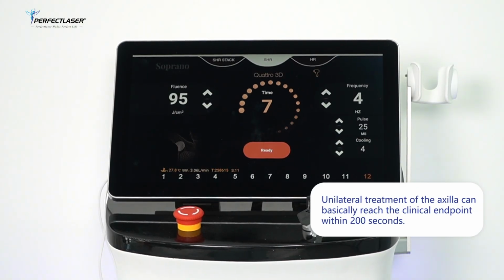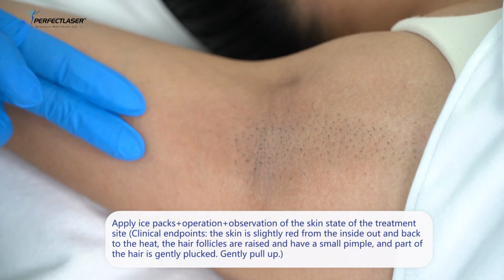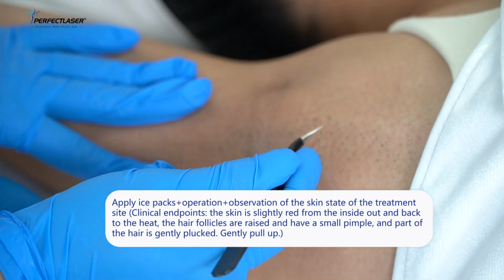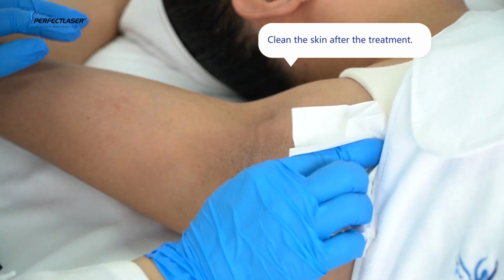Unilateral treatment of the axilla can basically reach the clinical endpoint within 200 seconds. Clinical endpoint judgment: the skin is slightly red, with heat released from the inside out. Part of the hair can be gently pulled up. Clean the skin after the treatment.